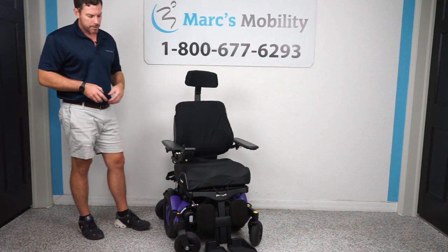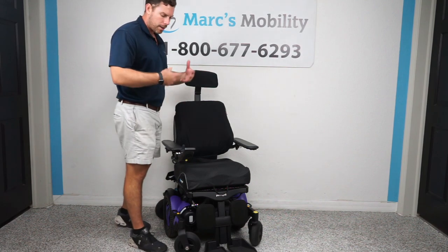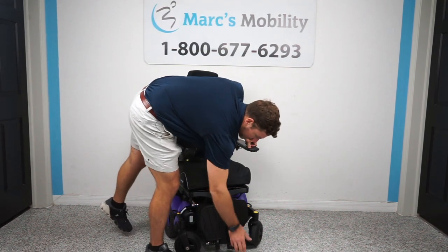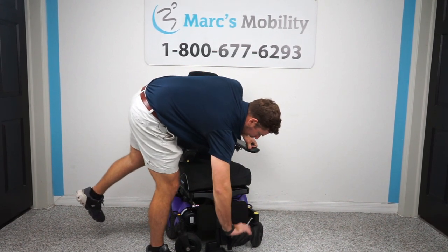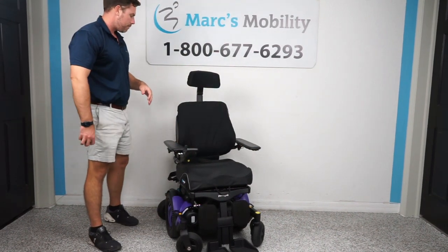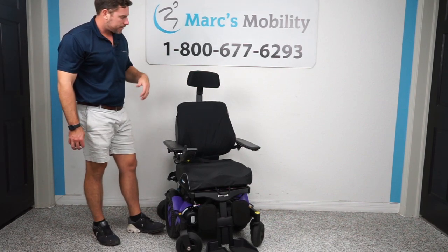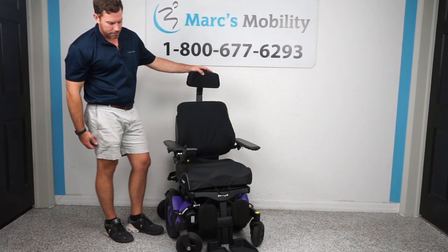It's fully customizable for whatever you might need. So if it's not the color or exact size you want, let us know and we will adjust that for you. Footplates flip up on both sides for easy access getting in and out. This unit has built-in tie-down points — two in the front and two in the back — for any type of transportation. This unit takes 60-amp batteries, has a 300-pound weight capacity, and gets about 15 miles on a full charge.